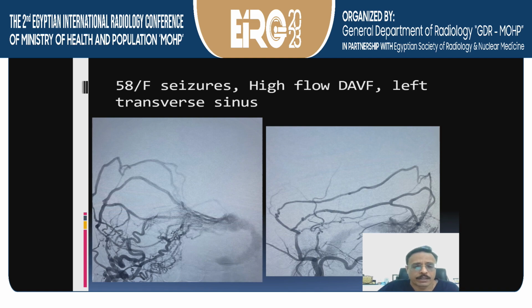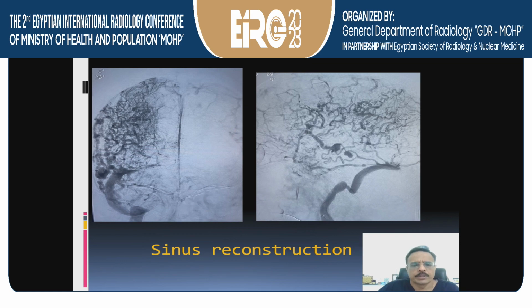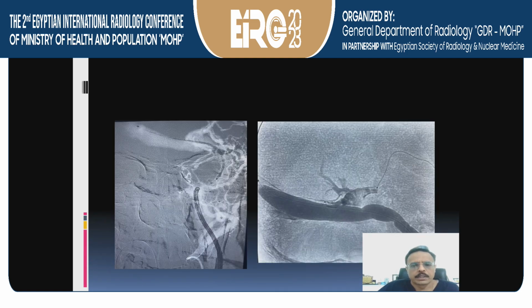The right sinus was anyway very hypoplastic. Multiple feeders opening at one point. You want to preserve the sinus from vertebral artery, from ICA as well. Massive venous congestion. You can see the right lateral sinus is not present, so you want to preserve that left sinus. So again, the RC balloon has been taken. We took 2 microcatheters for good flow control. You can see the 2 microcatheter tips there from right side and left side.